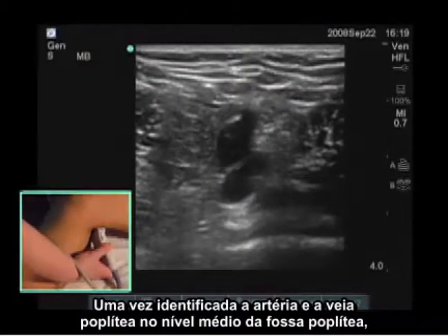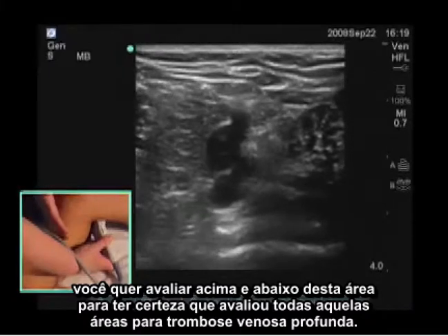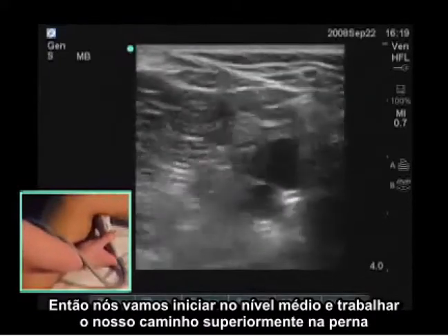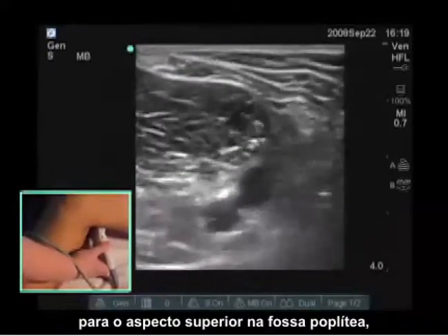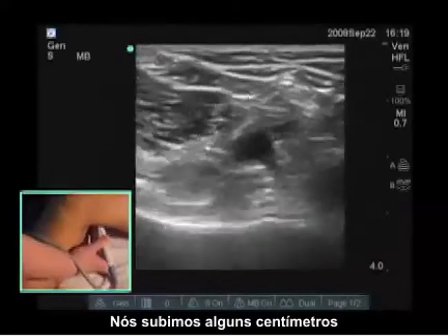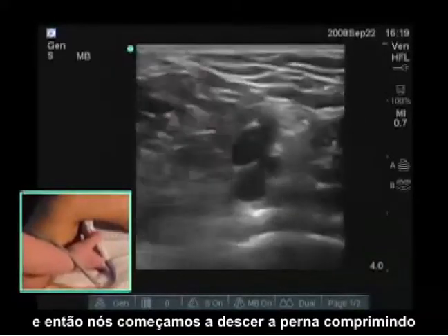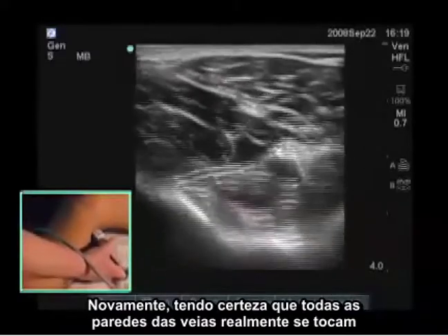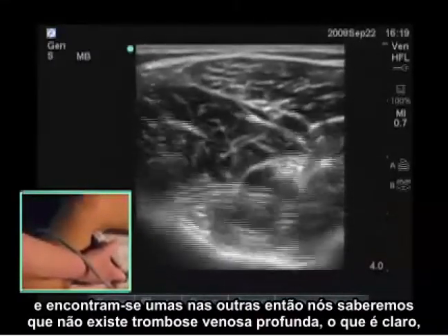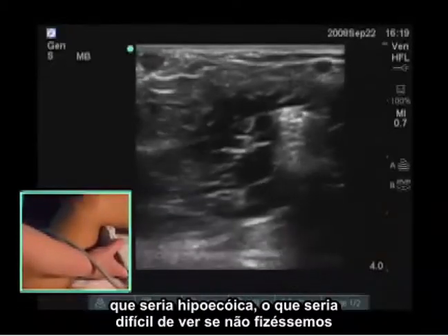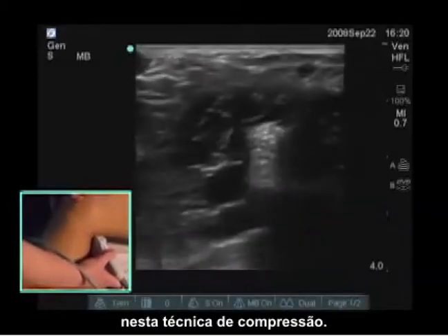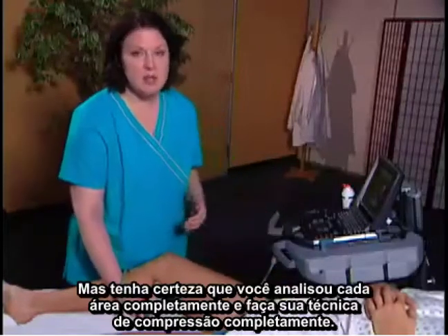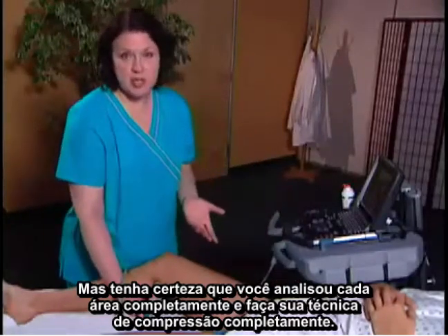Once you've identified the popliteal artery and vein at the mid-popliteal fossa level, you want to evaluate above and below this area to make sure you've assessed all those areas for deep vein thrombosis. Start mid-level and work superiorly to the superior aspect of the popliteal fossa, compressing all the way. Then start to move down the leg, compressing into the inferior aspect of the popliteal fossa, making sure those vein walls actually touch and meet each other. This confirms there's no fresh deep vein thrombosis, which would be hypoechoic and difficult to see without this compression technique. Those are the two steps for assessing the leg for DVT — just make sure you evaluate each area thoroughly and perform your compression technique completely.